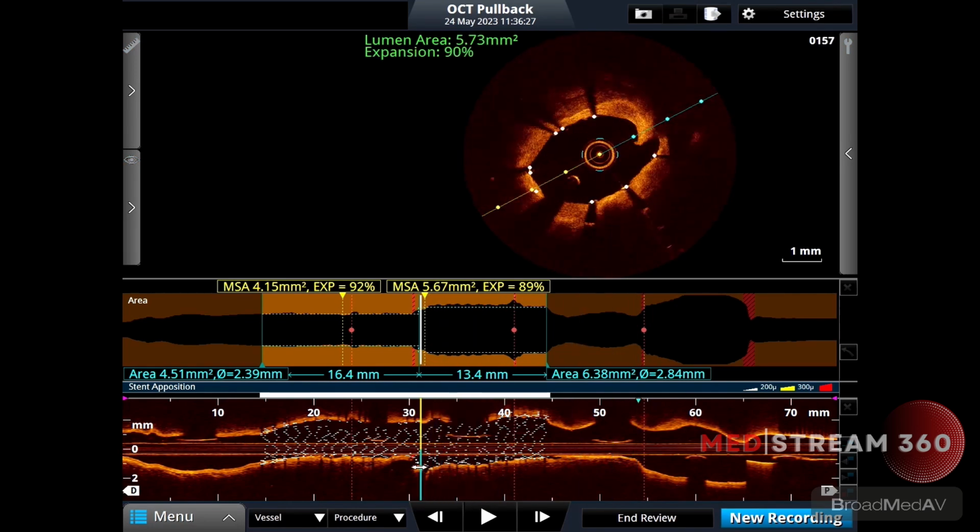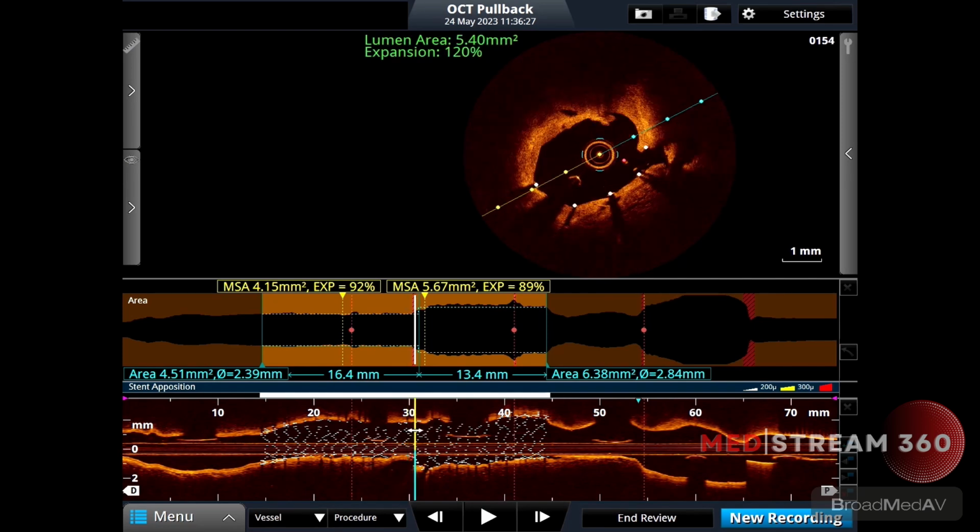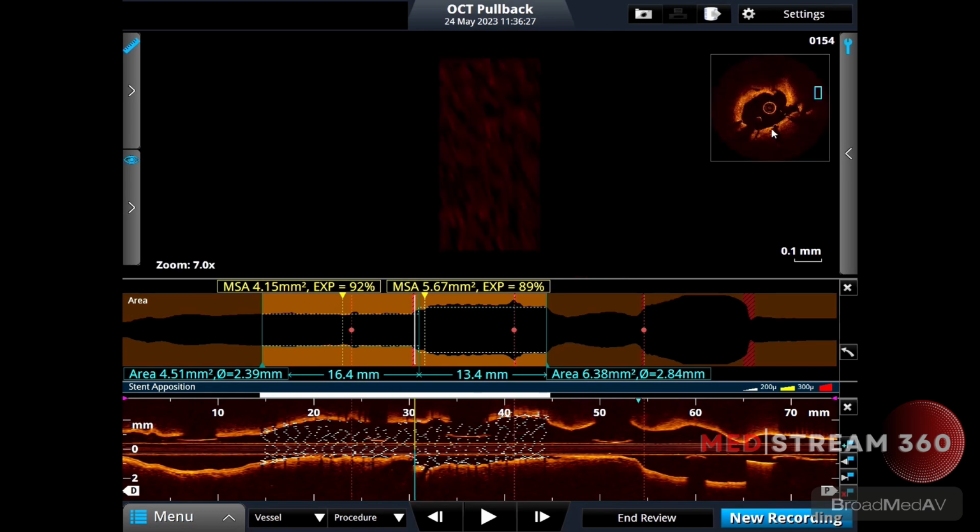And the next point is at the bifurcation part. We can see at 2 o'clock position the diagonal, the circle is there. And as it joins, there is definitely a pinching. So this is the ostium with a mild pinch, but I think it's good enough.